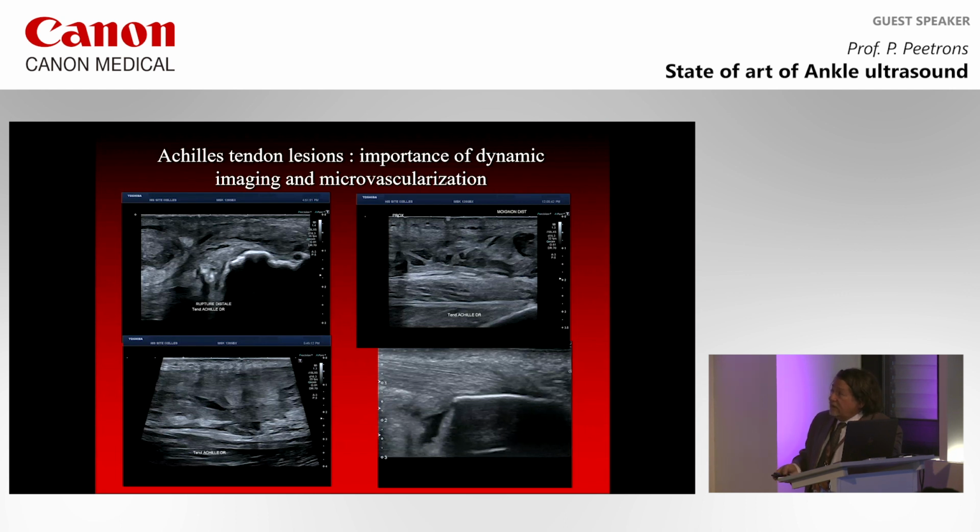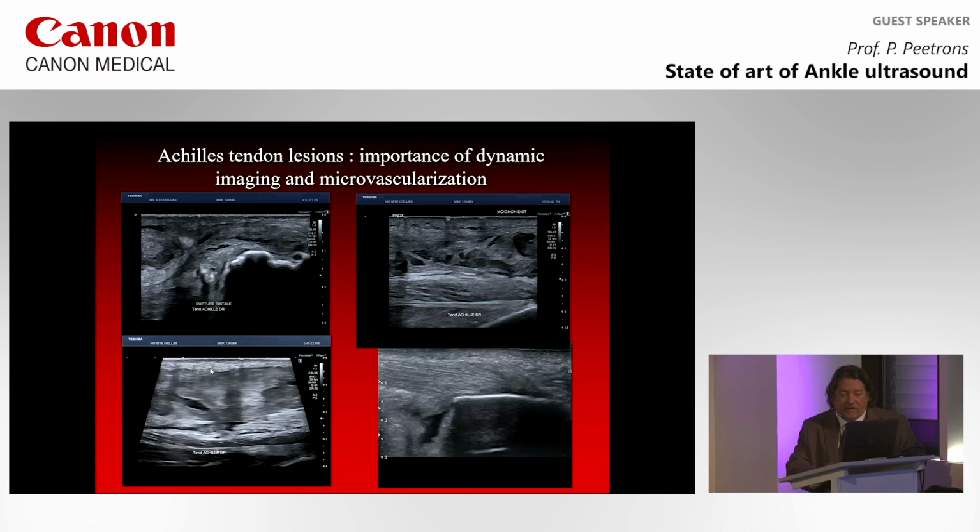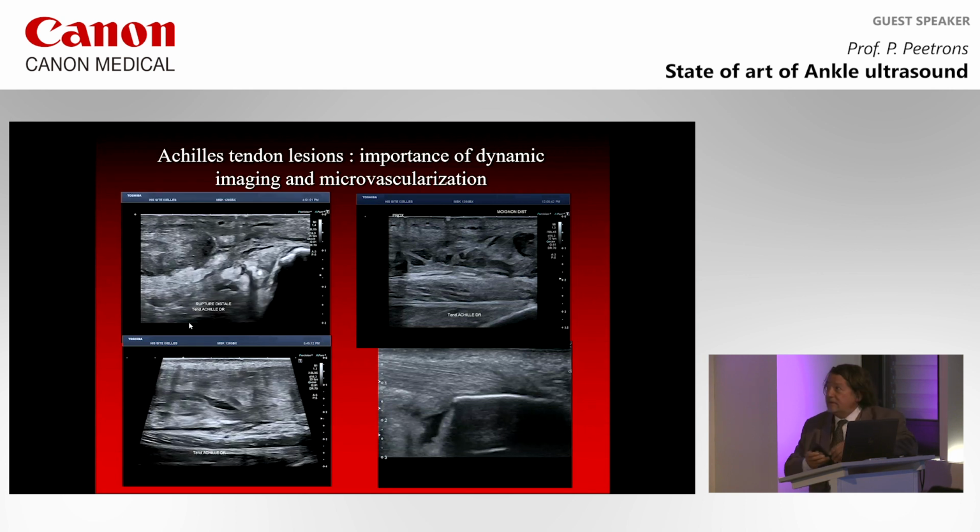Okay? Which tendon, or which tendons, are completely destroyed? This one, this one, this one, or this one? This one doesn't look to have any abnormality. Look at the dynamic imaging of this one. No, that one, I mean.